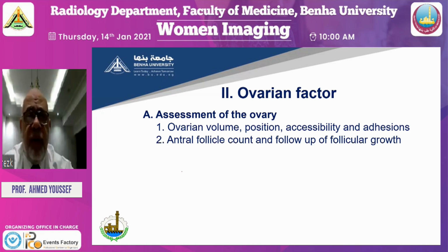Shifting to the ovarian factor, assessment of the ovary, either its volume, position, accessibility. Accessibility is very, very essential, especially in IVF. Most doctors who are not expert in IVF, and now most gynecologists want to work in this field, start to stimulate or give ovarian stimulation for the patient.